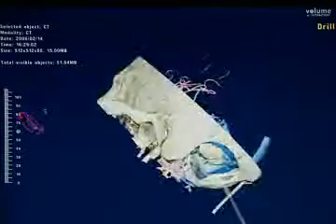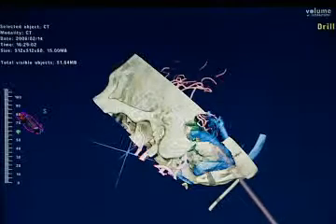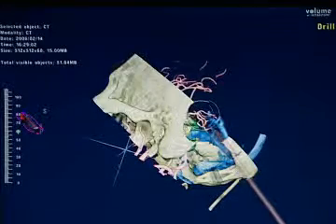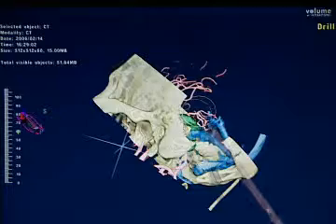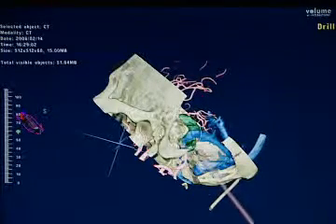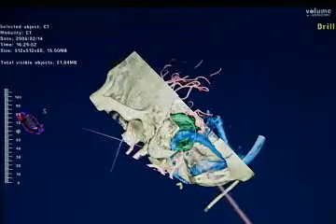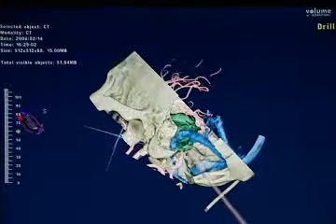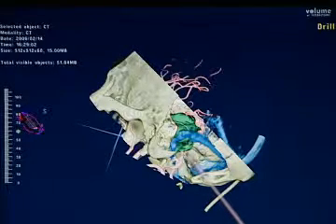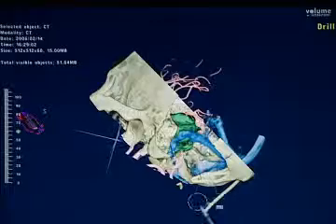And then finally, you can do a standard petrosal approach, taking it all the way down, taking the bone off the asterion, right, do a middle cranial fossa craniotomy, remove all the mastoid, and as you can see, when you are moving down, the resident will now be able to appreciate the amount of bone you have to drill, taking all the way the mastoid until you see solid cortical bone.